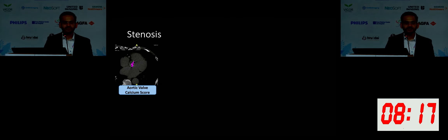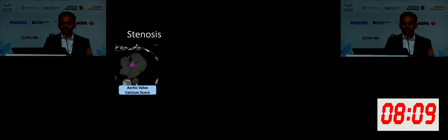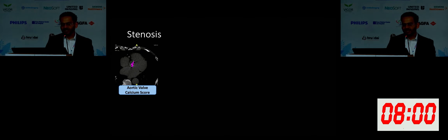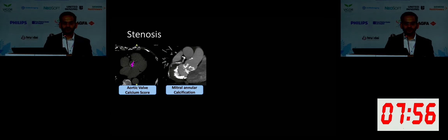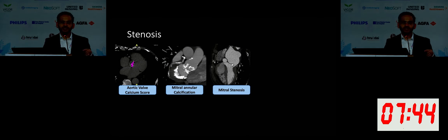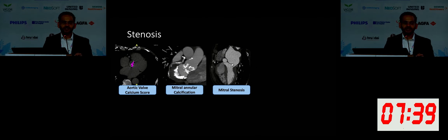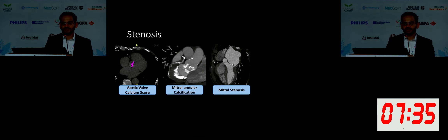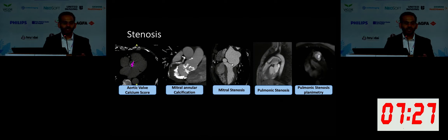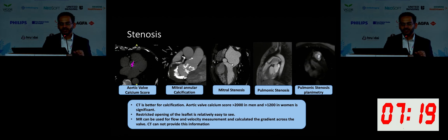Moving on to stenosis: aortic valve calcium score — we get a fair amount of referrals from clinicians to assess valve calcium score. This is a similar protocol to coronary calcium score; instead of segmenting the coronary artery, you segment the valve itself and provide a calcium score. Similarly, you can also assess for mitral annular calcification, which can sometimes be the etiology of a patient's mitral valve stenosis. You can also have a fusion of congenital abnormalities and stenosis. Here is an example of a uni-leaflet mitral valve that only has the anterior leaflet.